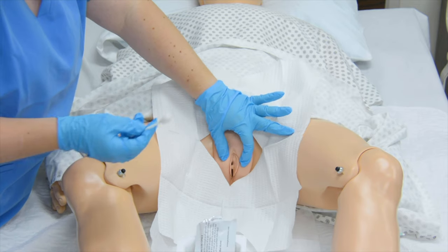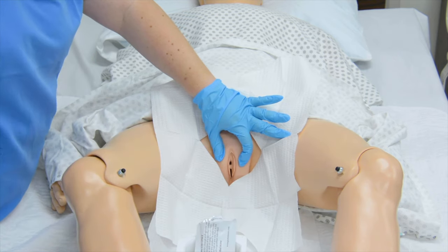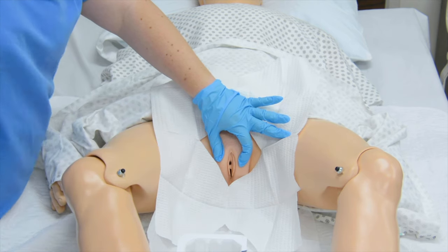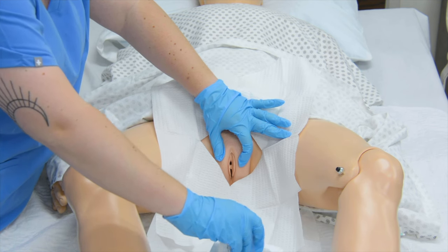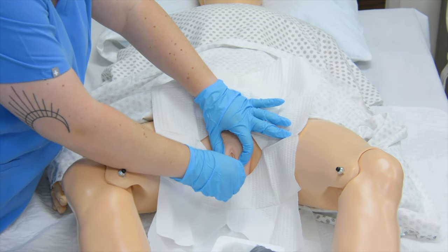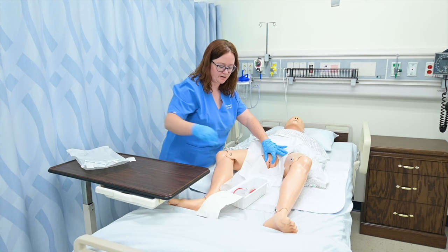So I'm going to spread her labia with my non-dominant hand, do one side, discard, the other side, discard, and then we'll do our final one down the center, making sure that we keep the labia spread until we're completing our insertion. Down the center, discard. I can just take this and discard it as well.